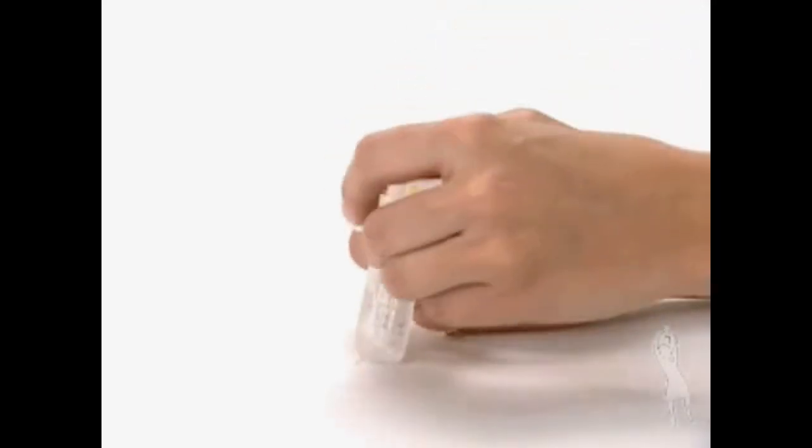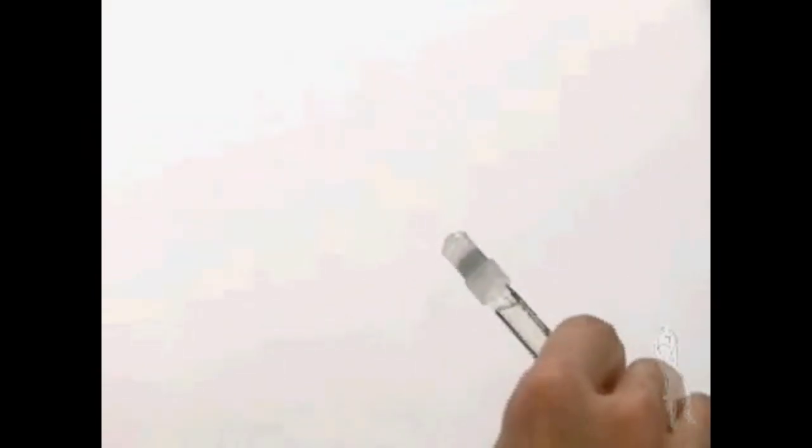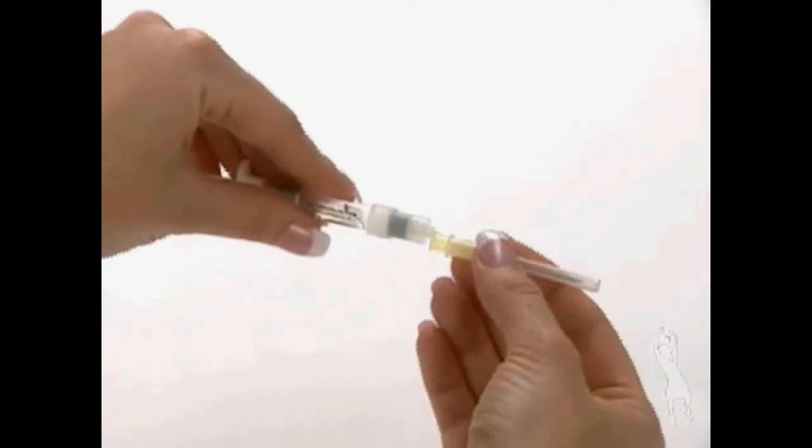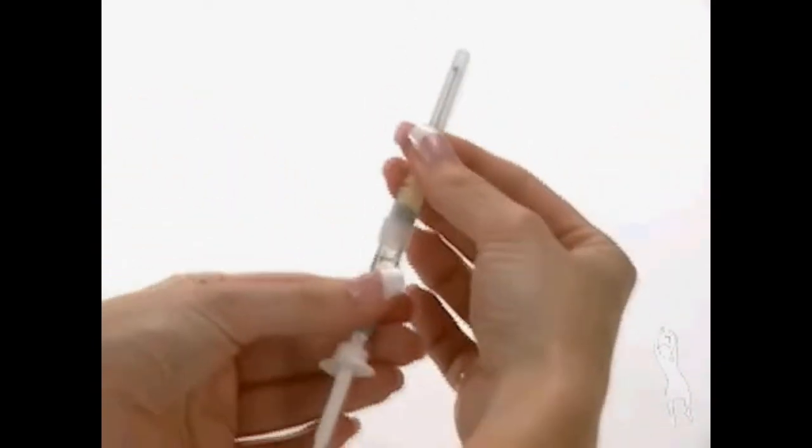Remove the wrapping from the yellow mixing needle 20 gauge 1.5 inch. Take the pre-filled syringe and remove the cover. Twist the mixing needle 20 gauge 1.5 inch onto the syringe and remove the cover of the needle.